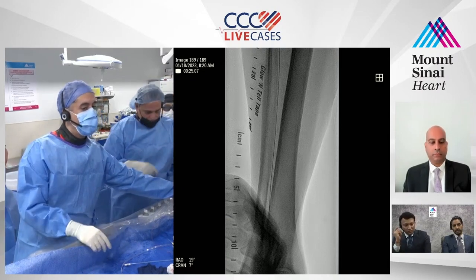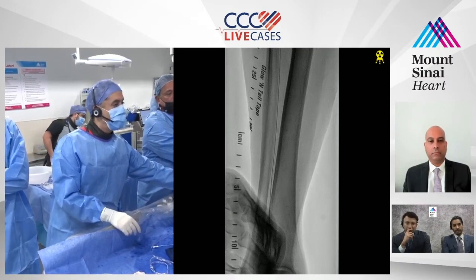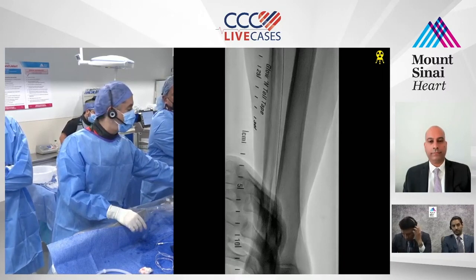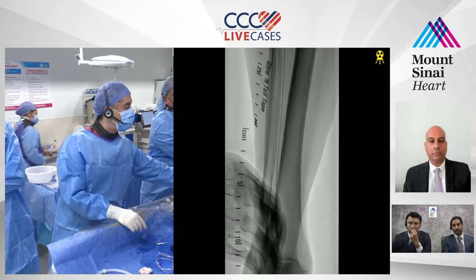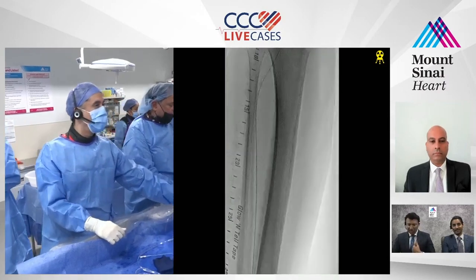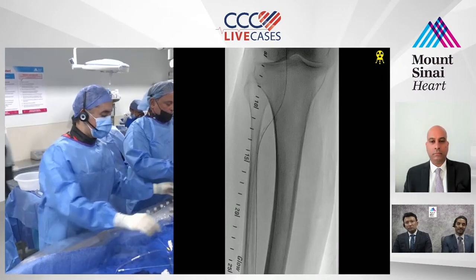So she definitely has some degree of vascular inability to tolerate distal access. You know, it's not very often we see people who have just from a radial access for a coronary angiogram or any kind of procedure to have the vessel become occluded. So I think this is not something that we would obviously advise for people to try on their first case as a single vessel runoff to access with the 5/6 slender.